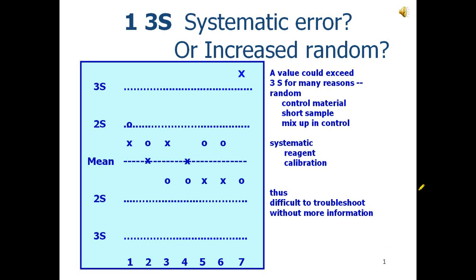And in 1974, when the CAP first proposed rules, there weren't computers in the laboratory. There weren't laptops like most of us have today. In 1981, when Jim Westgard and his group published the rules, they didn't have computers. They had a DuPont ACA analyzer in their lab, didn't have a computer with it. So you couldn't really do justice to the rules that he came up with, particularly the 10 mean rule. So they had to put in something that would stop them from having to count back as many as 9 runs. It's more than a week's worth of data to see if they broke a rule. So they put the warning in to reduce that problem. We don't discuss that anymore as a warning because the computer takes care of it.